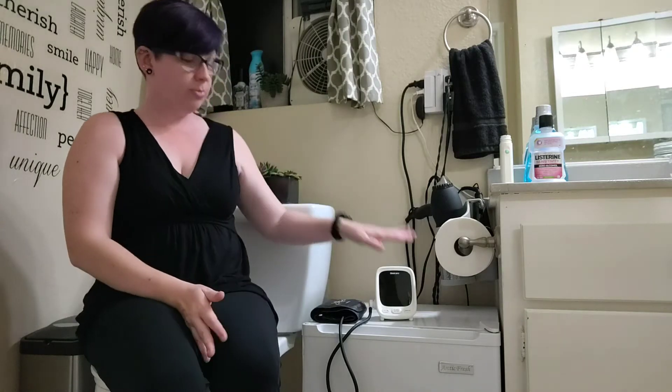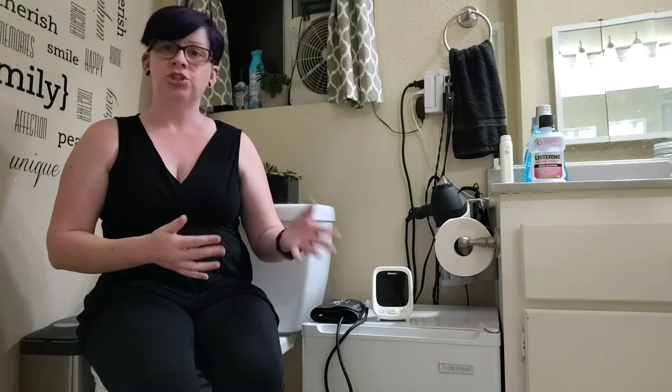Hi guys, we're reviewing a blood pressure monitor for you today. I'm in the bathroom because this is where we take our blood pressure readings in this house. My husband has high blood pressure and his doctor advised him to take it first thing in the morning before being too active, so once he gets out of bed he comes in here, sits down, and takes his blood pressure prior to getting dressed, showering, or using the bathroom.